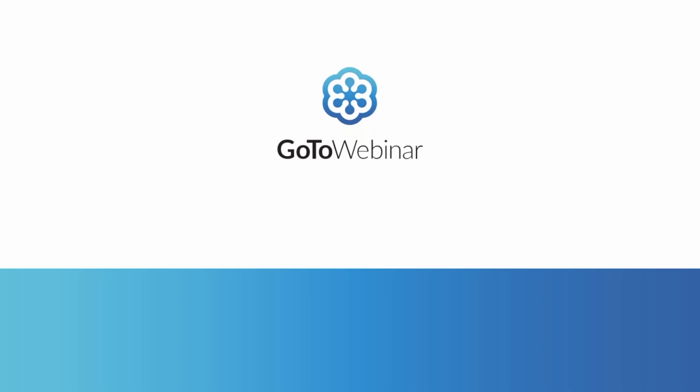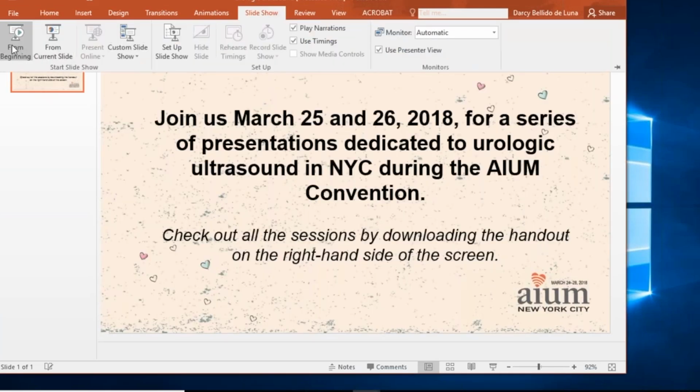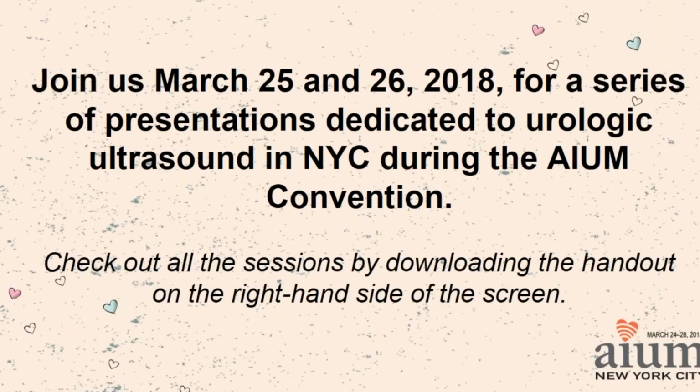Where do you usually take the Doppler signal? Well, you take the Doppler signal where it's the easiest to see. So in different patients, it may be mid-shaft dorsally, and in other patients, it may be mid-shaft ventrally. There are some patients who will have what's called focal veno-occlusive dysfunction. So some patients with Peyronie's disease have rigidity proximally and flaccidity distally. So you may need to measure proximally and distally to get both arterial and venous flow, because distally you can identify what's called a focal veno-occlusive dysfunction, which is not uncommon with Peyronie's disease.